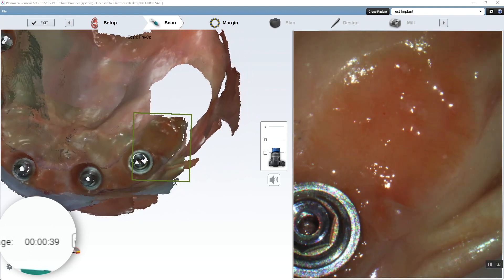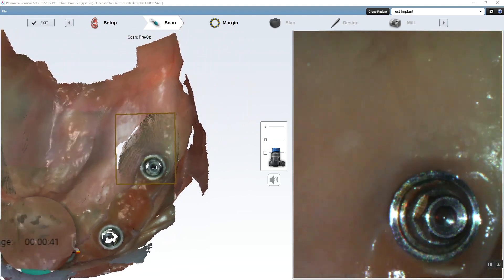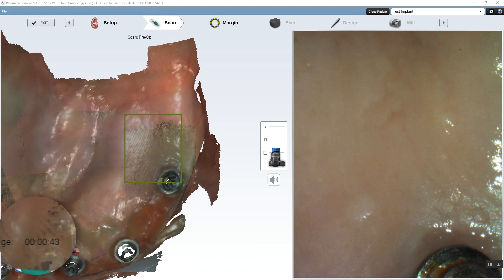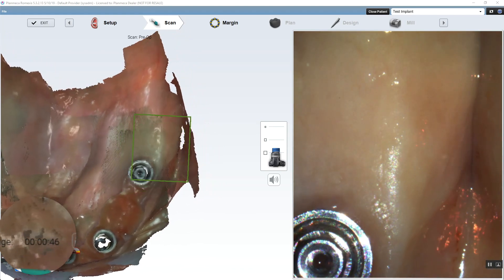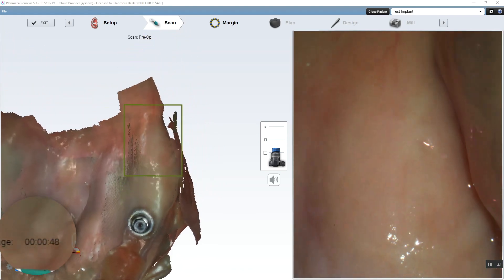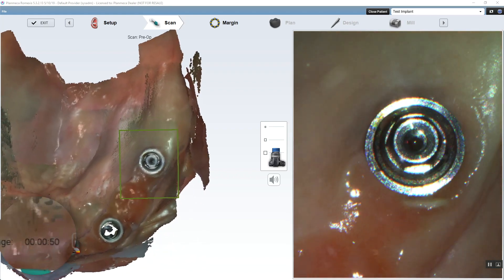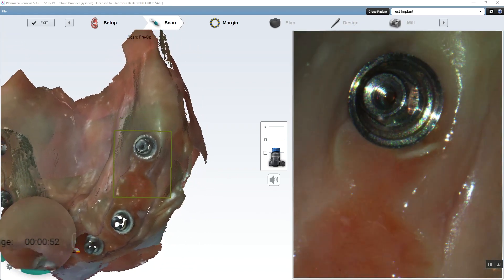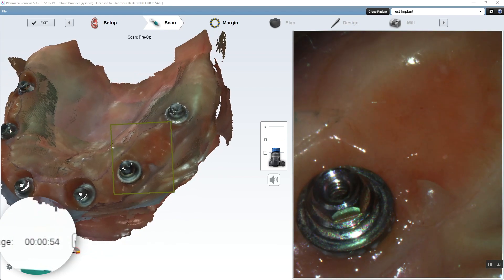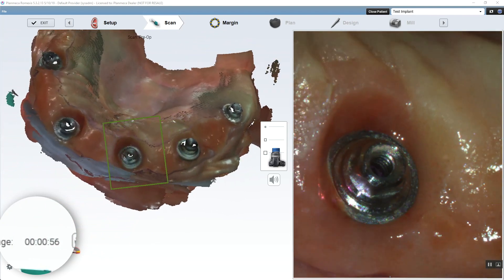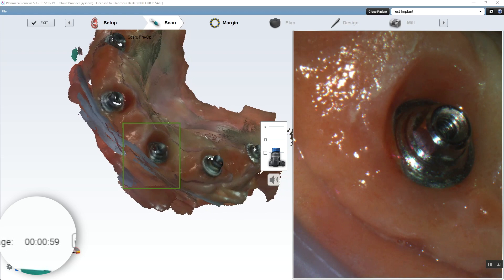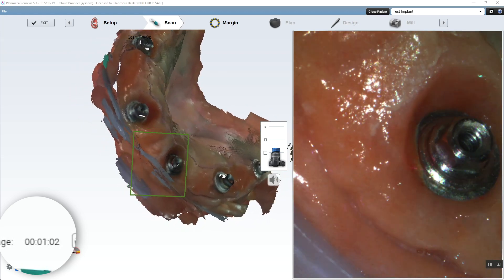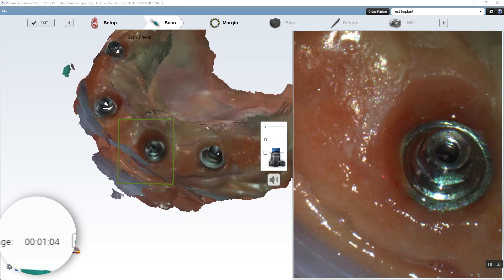Basically, it's stitching this into my previous scan of the palate, which is merged to my provisional, which is merged to the bite in space. So now, if I were to just ghost this on or send this to the lab, it would be in perfect vertical height for the VDO. This mesh would be floating in air at the perfect bite height. I'll show you that in Mesh Mixer in a minute.